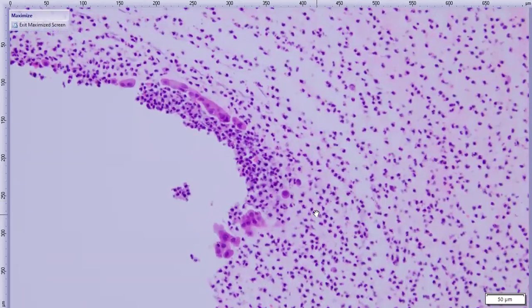And in order to confirm keratomalacia or collagenolysis, we look for islands of epithelium that are sort of drowning in the stroma. And we don't really have that here. We do have like one individual keratinocyte here.